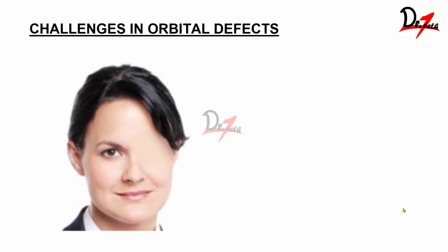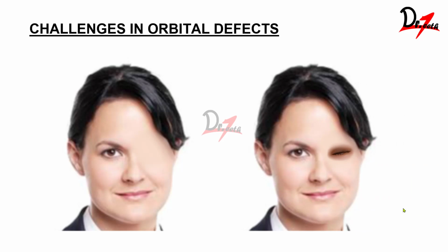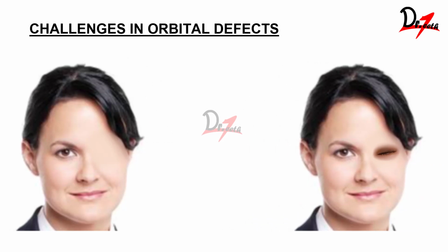What challenges do we face in orbital defect? If the surgeon has closed the defect with a flap, we don't have space for the prosthesis. Do we have? No. If we have retained the eyelids, that also is a problem.